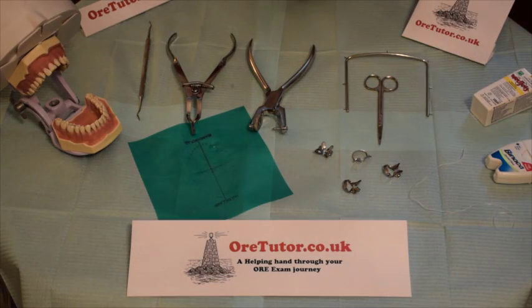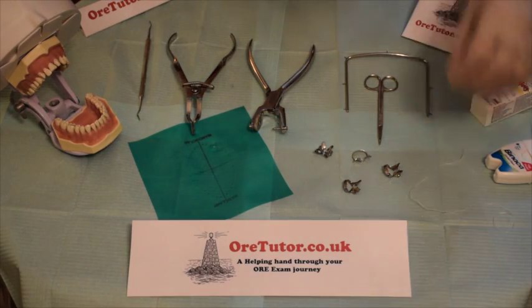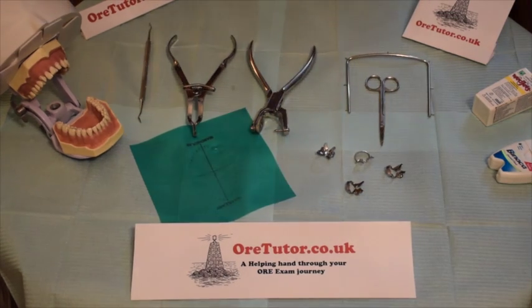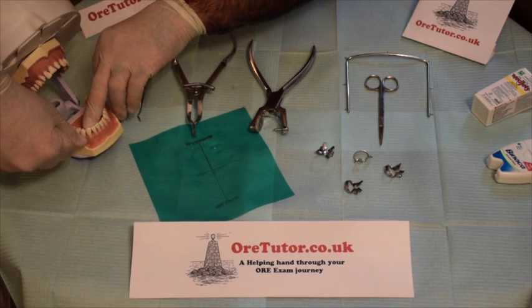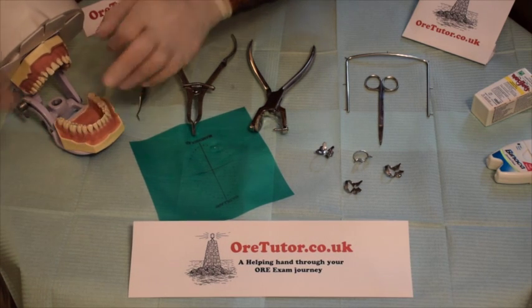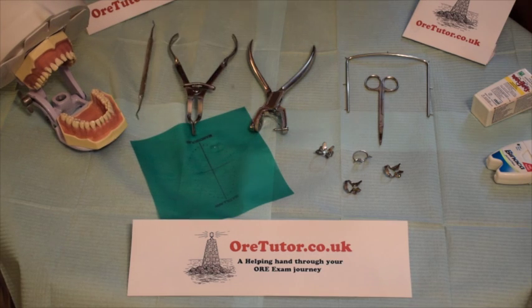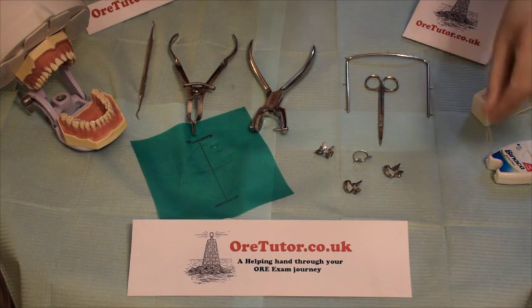Before starting anything, you need to pre-floss around the tooth that you're going to isolate to remove any packed or stuck food. For the lower right first premolar, pass the floss through the mesial contact and pull, then pass it through the distal contact and pull. Now you're sure that it's clear.